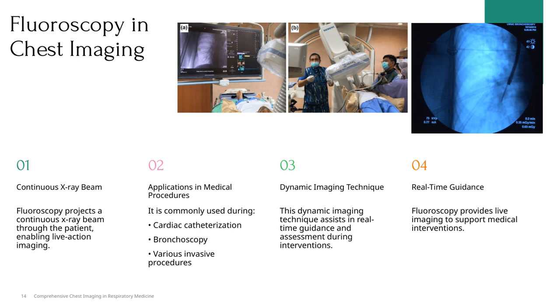in real time. This dynamic imaging technique is incredibly valuable because it provides real-time guidance and assessment during procedures. Whether we're navigating catheters or guiding instruments, fluoroscopy helps us see exactly what's happening as it happens. The key benefit here is real-time guidance. It supports clinicians by giving them live imaging support during interventions, which enhances precision and safety.